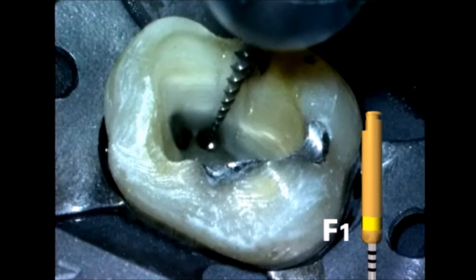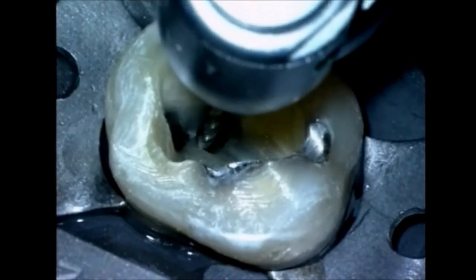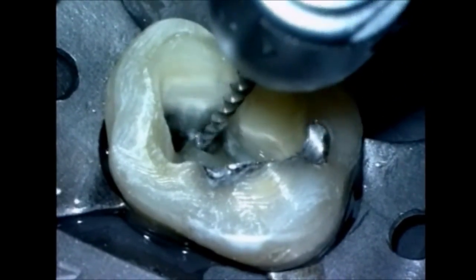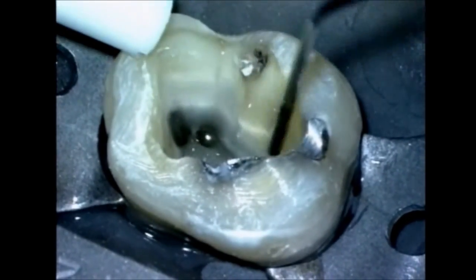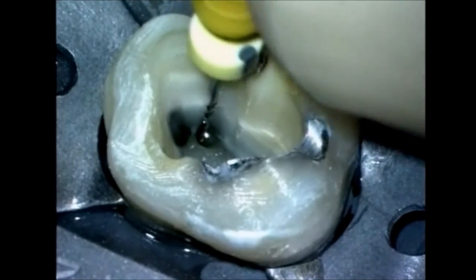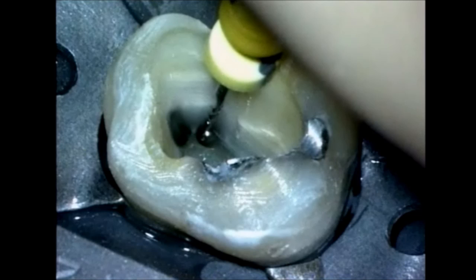Finisher 1 is carried into the canal, it's allowed to move just short of length, and then it's immediately withdrawn. This instrument will load up quite a bit of debris and auger that debris out on its cutting blades. Following the use of Finisher 1, we gauge the size of the foramen with a 20 hand file. We tap on its handle to make sure that we can't displace the file periapically. If the file is snug at length, we're ready to finish.